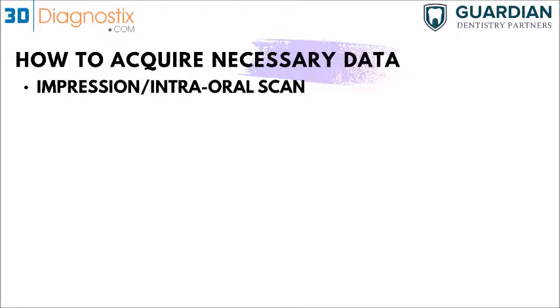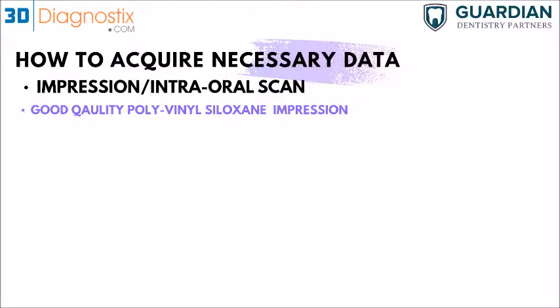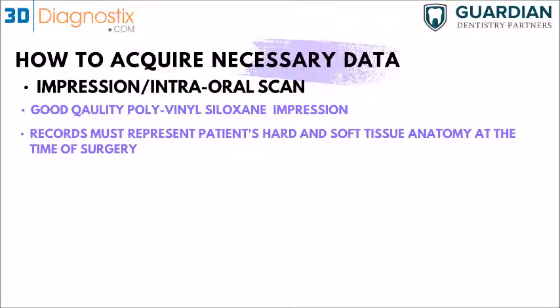So we've mentioned before, again, when a patient is dentulous, you need to have an impression or intraoral scan. The thing that we recommend, of course, is when you take an impression, it needs to be a PVS impression and not an alginate impression. The reason why is that PVS is more dimensionally stable. So once you've taken the impression, you can just send it out and then we can pour it in the office. So it's just more reliable and does not show these discrepancies with the setting of the model, because with the exothermic reaction, of course, of the model setting, there will be some shrinkage if you use alginate.